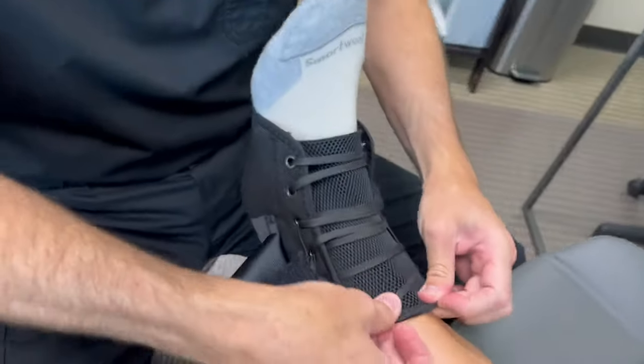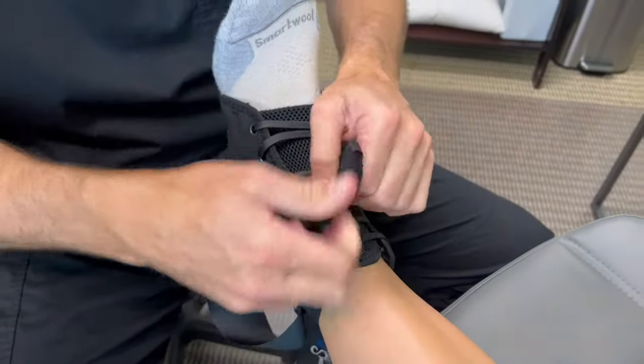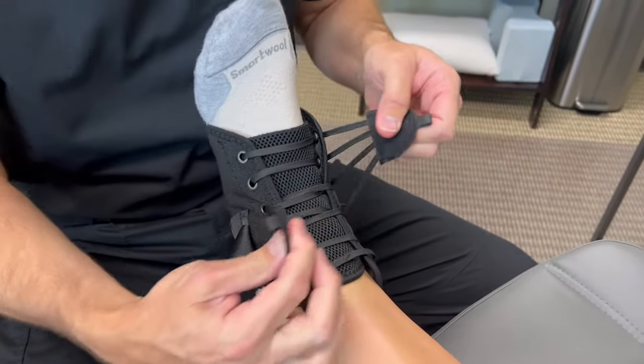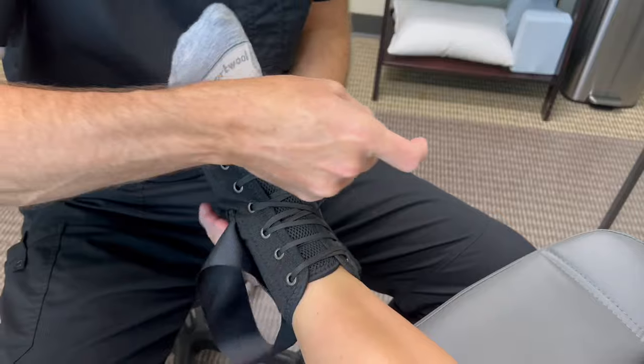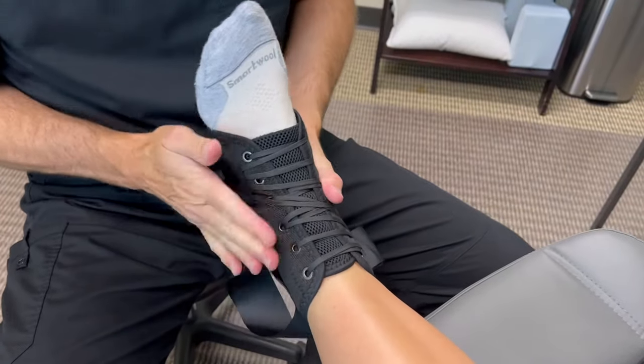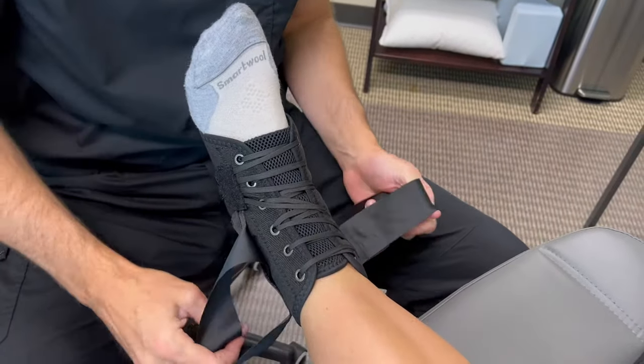Once you do that, again make sure the tongue's up, and you want to just snug these two — that'll get all the laces tight. Get it as tight as you can without feeling like it's hurting you or cutting off circulation.